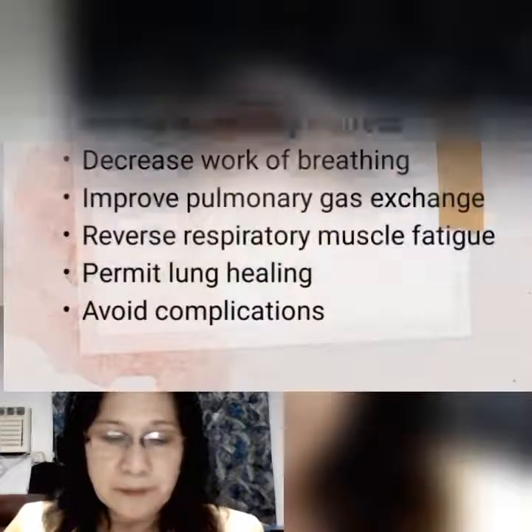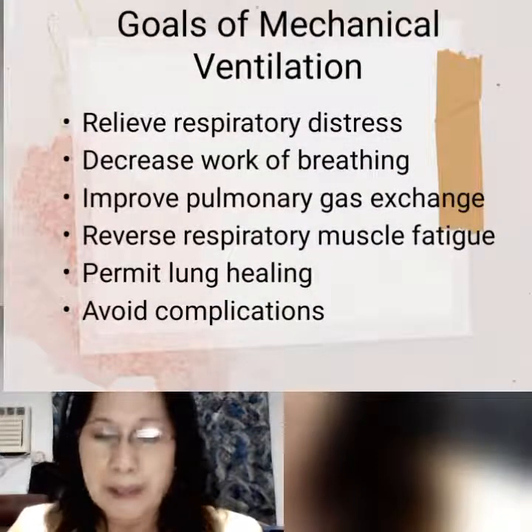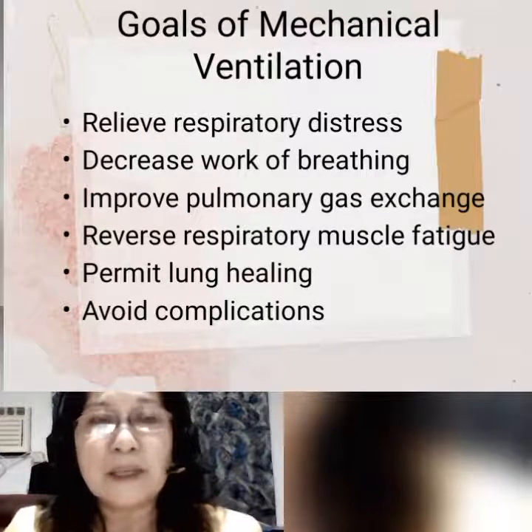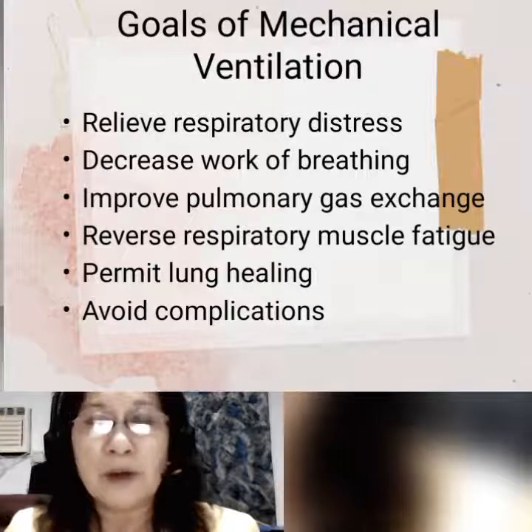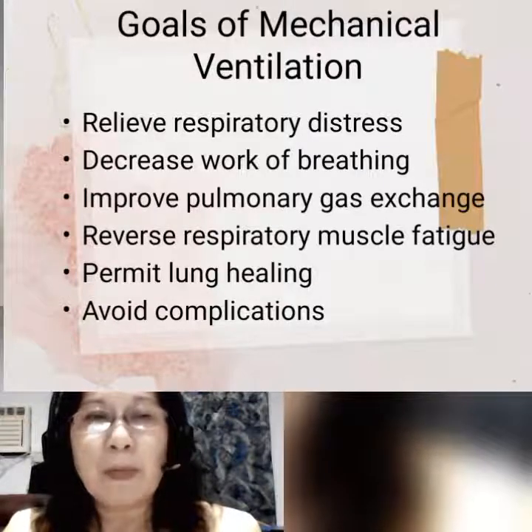So what are the goals of mechanical ventilation? The first is to relieve respiratory distress. There are critical patients in the ICU who suffer from respiratory failure, and of course they will have symptoms of respiratory distress.